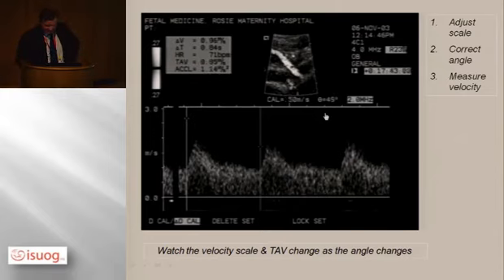If we play that again, we start at about 96, 80, 73, 67, 73, 78, 81, 87. And that is between an angle of 20-something and 49 degrees. So the angle does make a very significant difference to velocity.